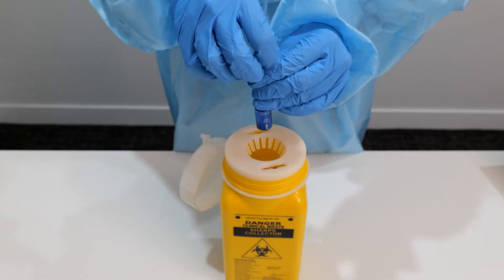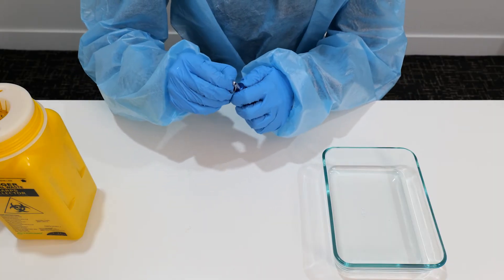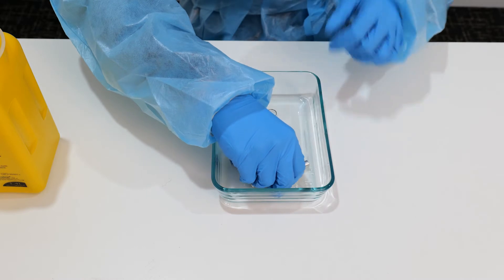SNAP-IT is cleaned by first rinsing the device under running water. The device is then disassembled, and each component rinsed with water or a hospital grade cleaner, dried and then reassembled.